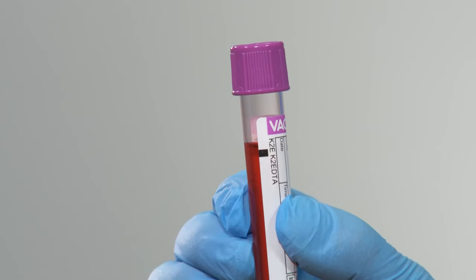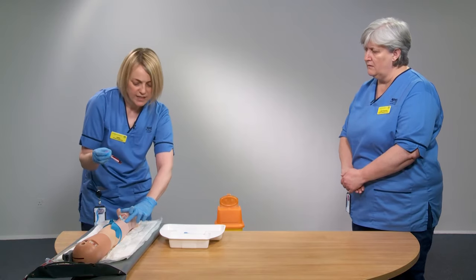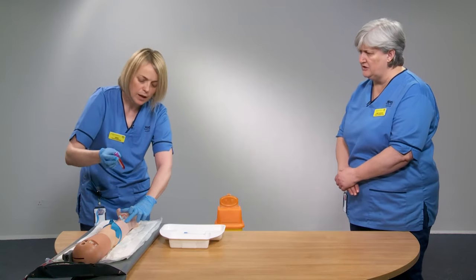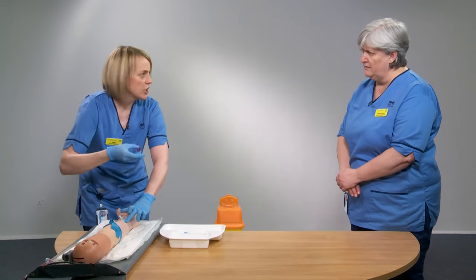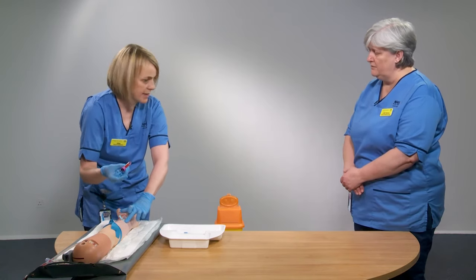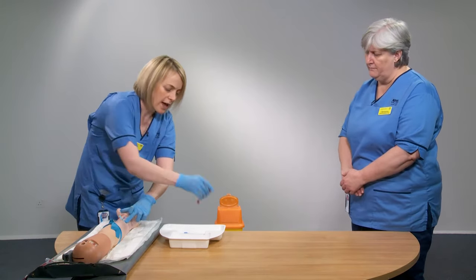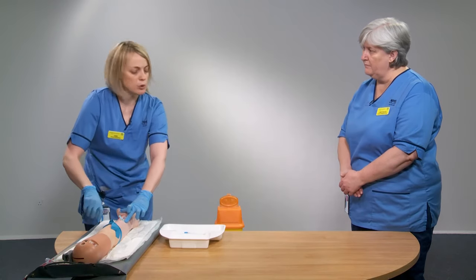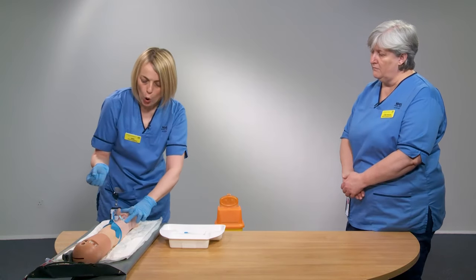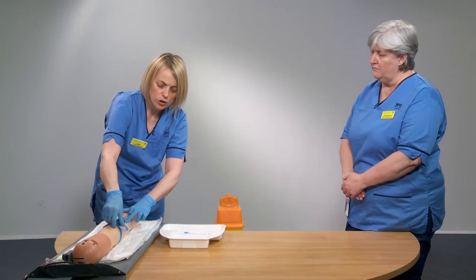Each blood bottle has a black line indicating the correct fill level. Once the bottle stops filling, disconnect it and invert it a couple of times to gently mix the blood with the additives. Do not shake vigorously — this can damage blood cells, causing a haemolysed sample, which can affect your blood results. Place it in your tray and attach further bottles in the correct order if needed.